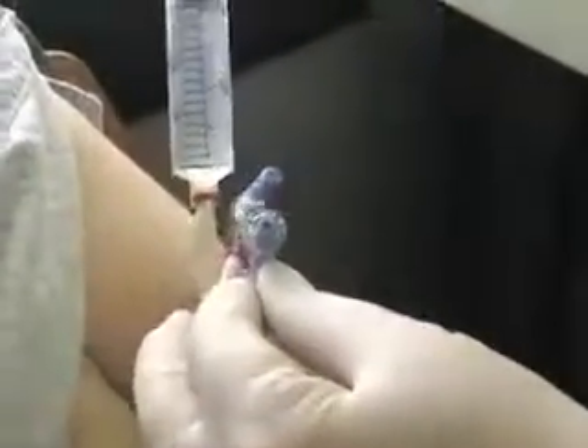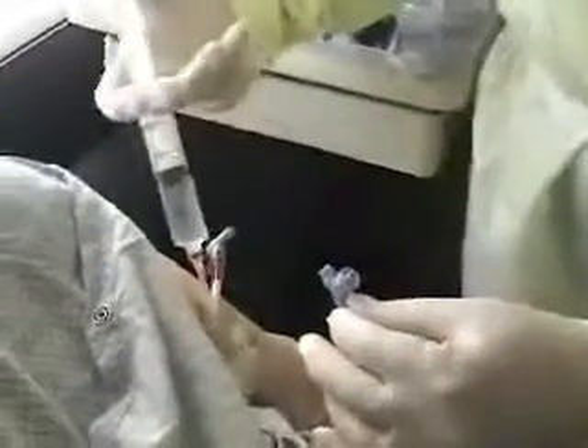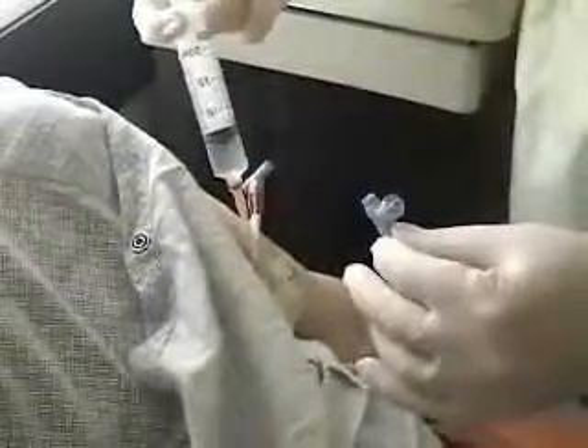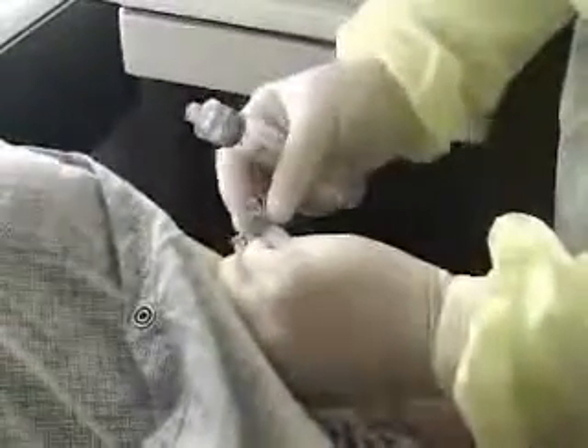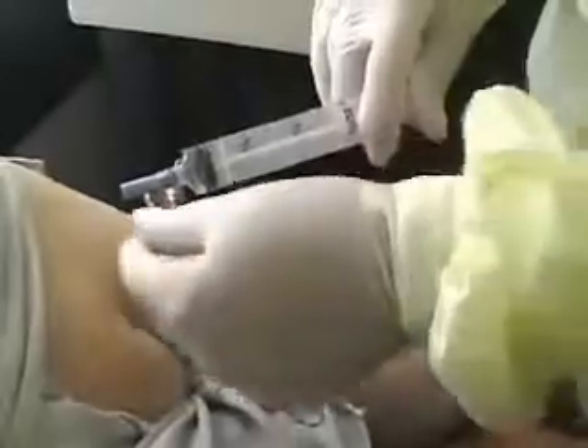Now we have our sample, and we're going to flush with 20 cc's of normal saline. You just want to flush and then stop, flush and then stop — that clears out the PICC line better. Once again: flush and stop, flush and stop. I'm going to go through the connector port — just so it's clear too.